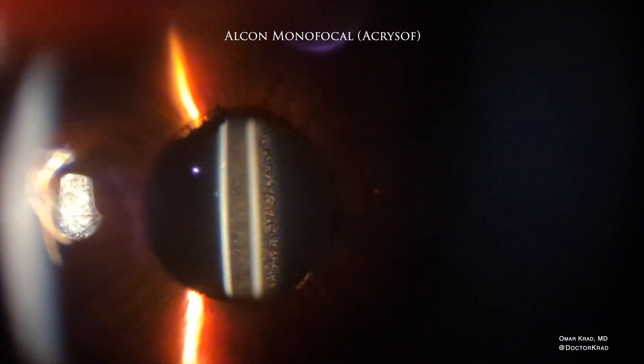Here you have an Alcon monofocal lens with the Acrosoft material, and you can see so many glistenings in the lens material. This patient was not bothered by it, but these glistenings form very slowly and too gradually for a patient to notice symptoms.